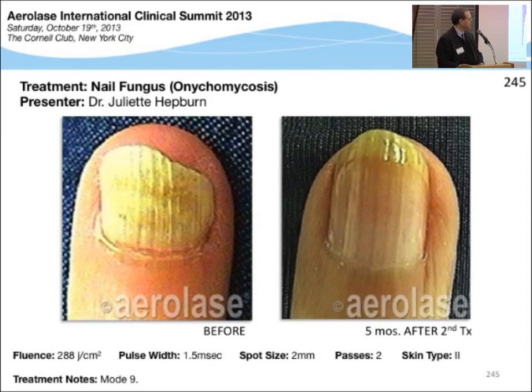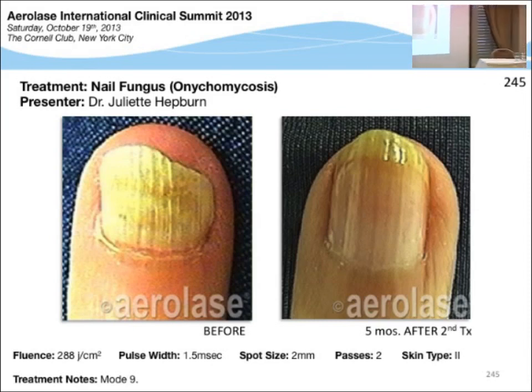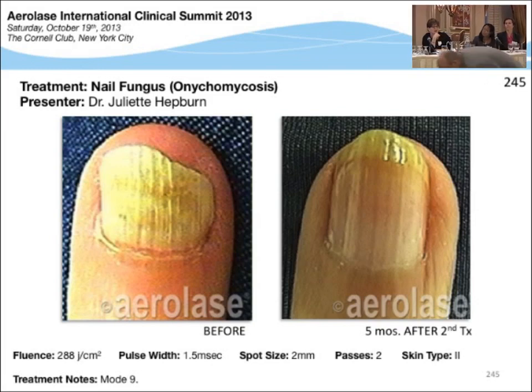I also trim the nail down very often so that it's not sticking up. If you don't have a Zimmer or a cooling agent and you don't want to give a ring block, you can use ice. Ice in a glove, you just put it on the toe, move it away, do a pass, go to the next toe, do the same, and then do your second pass afterwards.